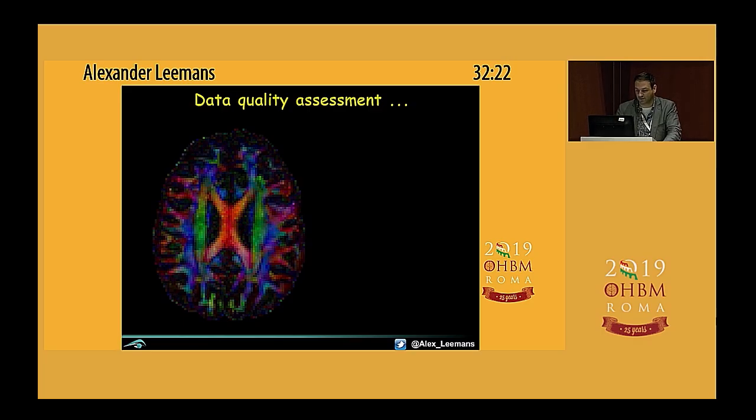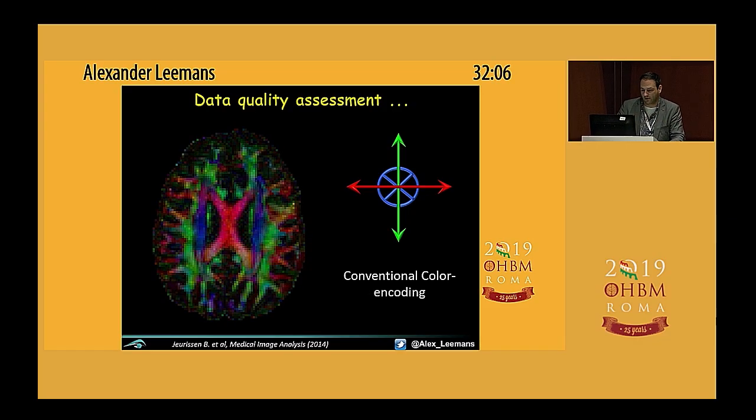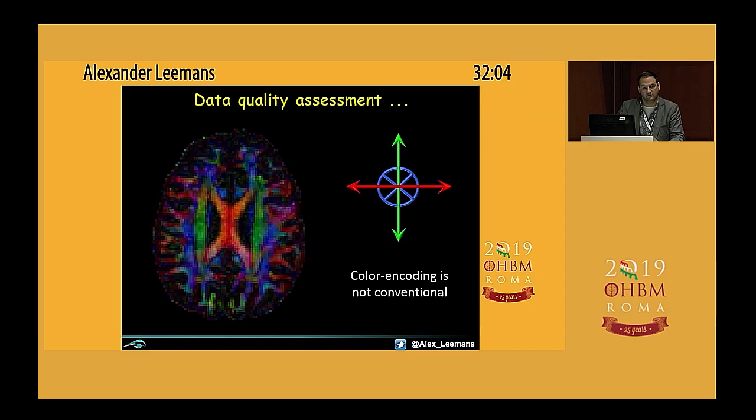Yeah, exactly. So the color convention is typically green front to back, red left, right, blue up, down. And I was actually amazed to see that, it was actually quite silent. And I was like, do I see any artifact? But you were not focusing on the color. So if you focus now on the correct one, well, it's a huge difference, right? So the convention was not conventional. I mean, the convention of the color encoding was not normal, right?